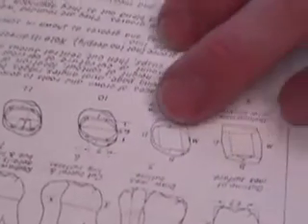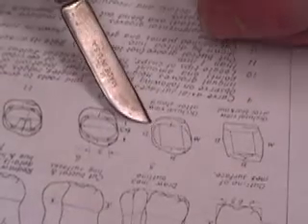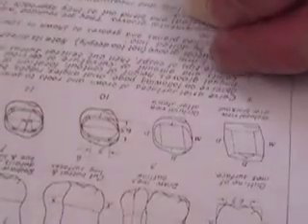Okay, now we're going to move to an occlusal view. So, we started some of the initial cuts in that occlusal view, but we're going to continue the rounding here a bit. So if you look over here, we're going to be rounding this corner a bit. We'll be rounding in these other two lingual corners also a bit.